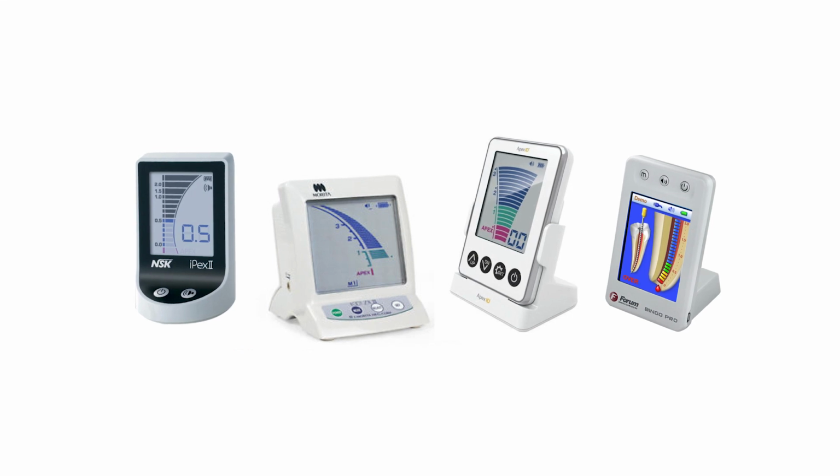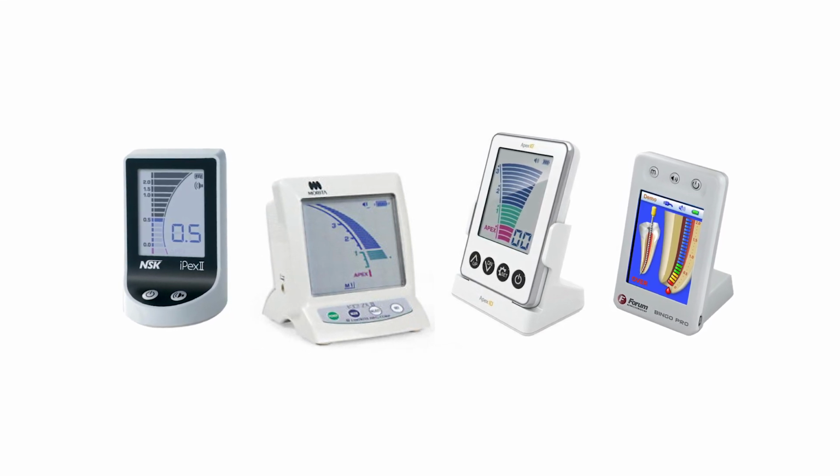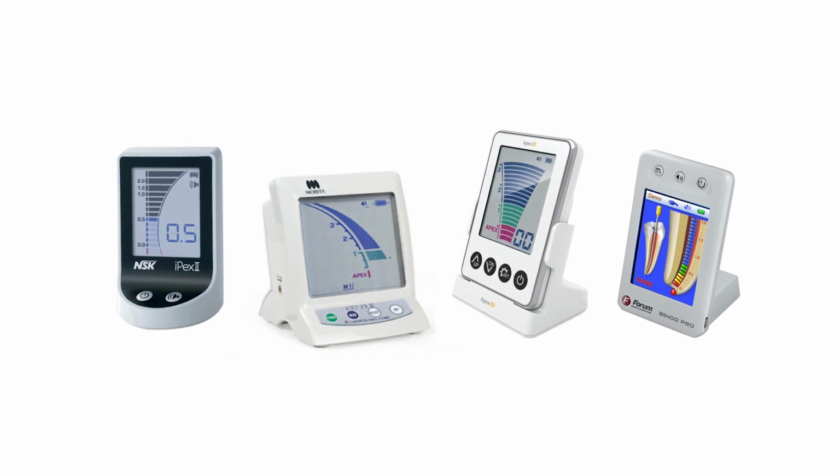The second thing to recognize with your apex locator is ignore the numbers. Every apex locator on the market, as you can see from the image here, has numbers in a scale on the side. Those are not millimeters. They're only there to give you a rough guide of the progression as you pass down the root canal. Don't make the mistake of thinking that they are, when you're at 0.5, you're 0.5 millimeters from the apex. That's not how apex locators work.